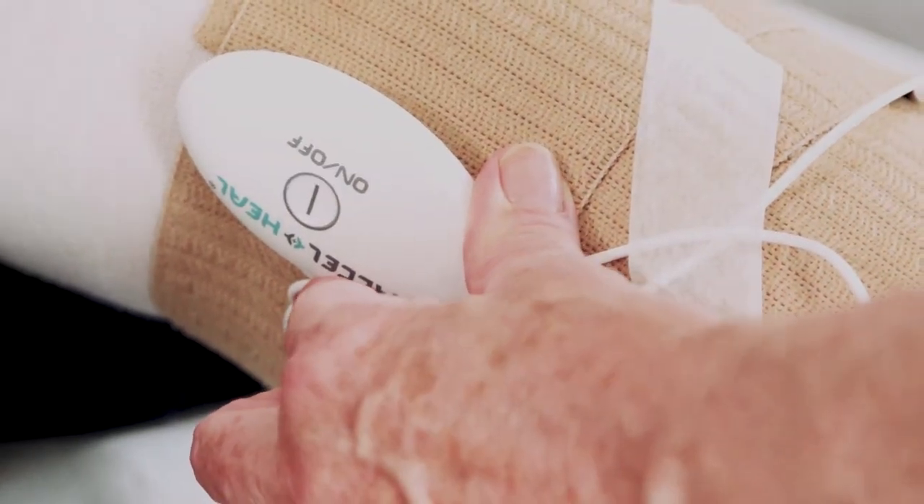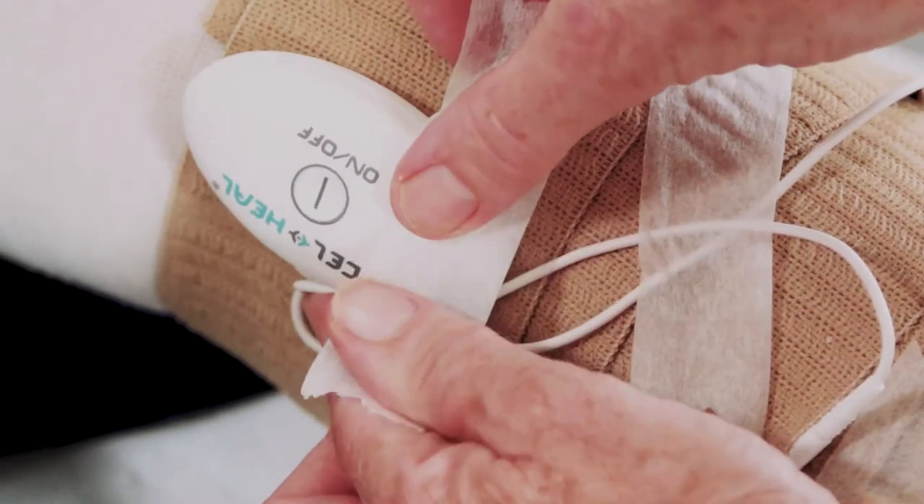Secure the wires and device with tape at the top of the leg, away from the tibial crest, and secure with a tubular stockinette.